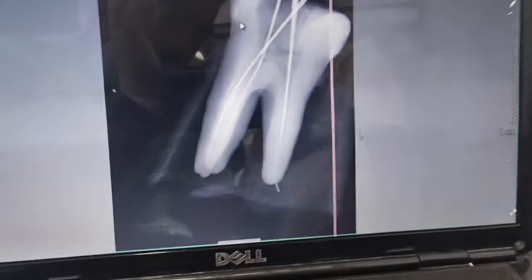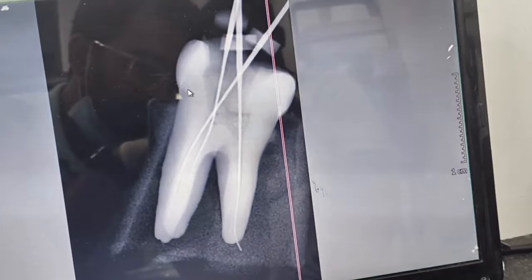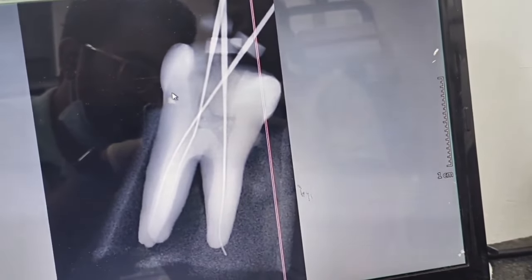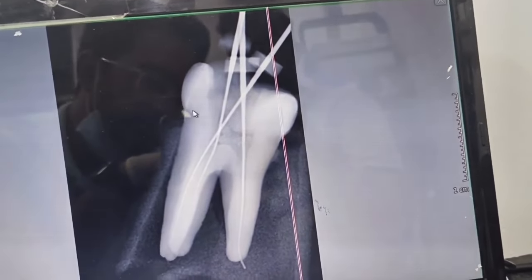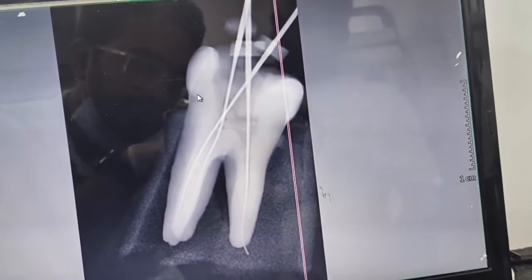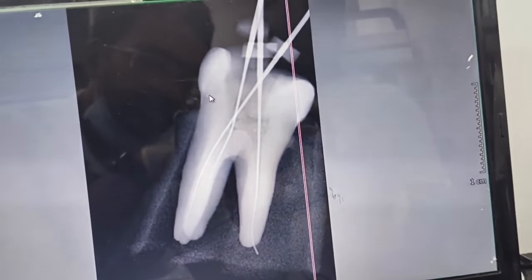How to do this? We have to reduce the length of the rubber stop. You have to reduce the length by using an endo block, which I have already shown you in the previous videos. So you reduce the length, or you can use the apex locator in the patient. This is the traditional way of doing it, and you can recheck with apex locator as well.